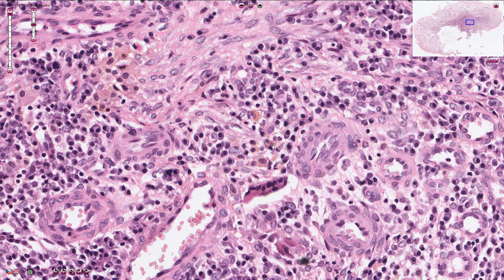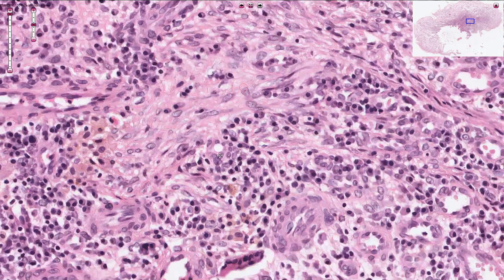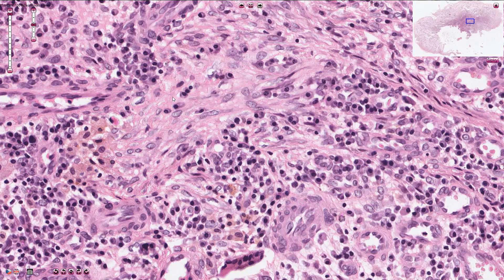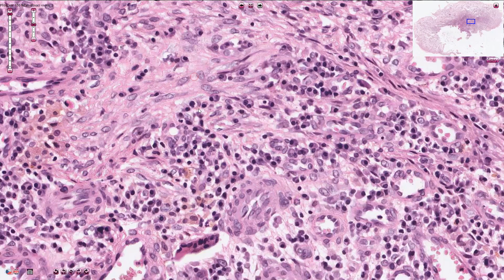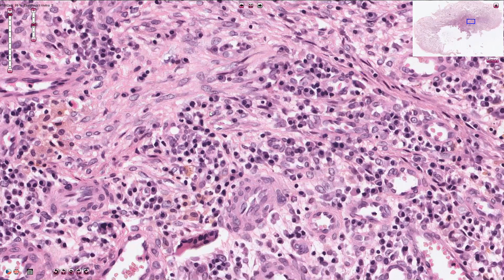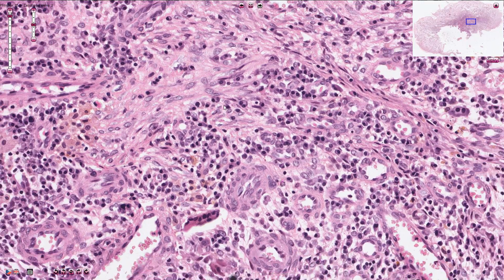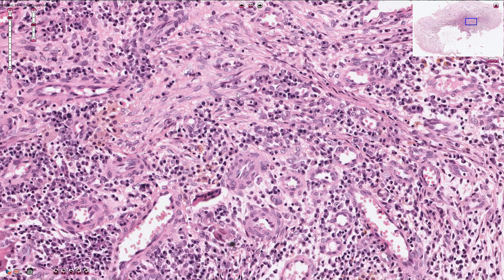Here we can see the larger cells with oval vesicular nuclei — these are fibroblasts, and fibroblasts produce collagen fibers. The structures in the interstitium are actually collagen fibers. Over time, there will be fewer inflammatory cells, fewer fibroblasts, and fewer capillaries in the granulation tissue, with more and more collagen fibers accumulating. Finally, the granulation tissue will mature into scar tissue.